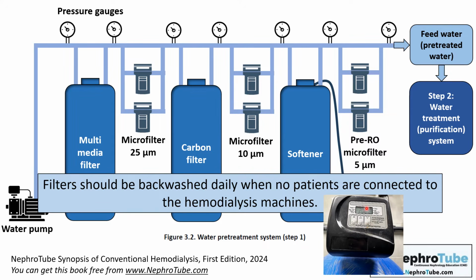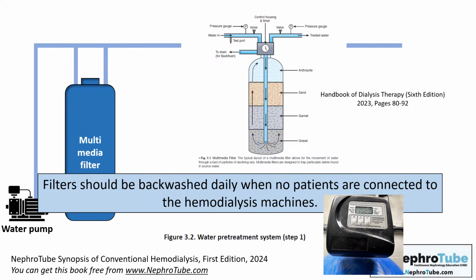You can adjust from this apparatus a timer, so the backwash can be done automatically in the absence of the water unit instructor, in the absence of hemodialysis patients connected to the hemodialysis machine. I will show how backwash works. For example, on the multimedia filter, and the same will happen for other filters and tanks.